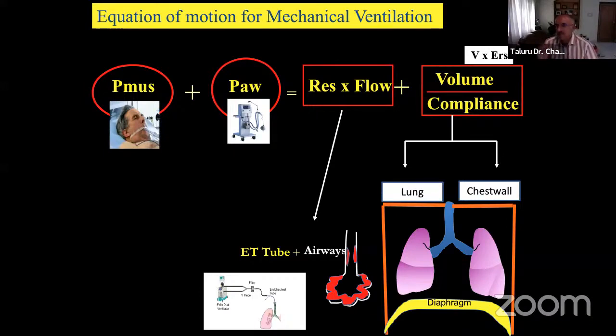So the two things you have to understand here, I have been stressing on this fact that once your plateau pressure goes up, PIP goes up, if you think that the lung is normal, you auscultate, you clinically see, you have done something where the chest wall has been restricted, then the pressures go up, then you can be more bold, you can move the parameters of the lung protective ventilation a little further, where you can give a PEEP of 10 and you can have a plateau pressure of 20-25. It's acceptable because we know, just because somebody is in a reverse Trendelenburg with a pneumoperitoneum, probably this is happening.